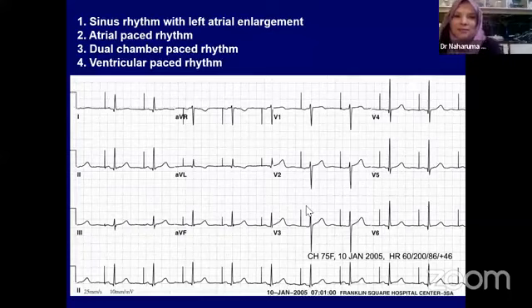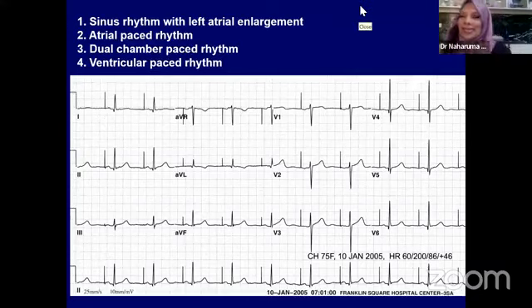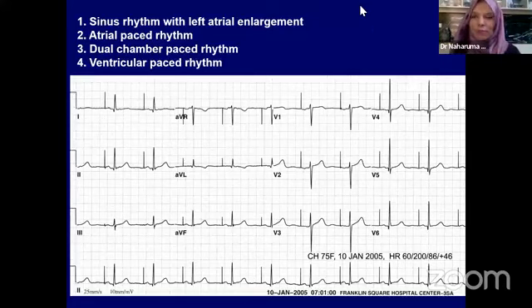Yes, sir, to correlate. And there is another question that Dr. Arif Hussain asked: how frequently should we do an ECG in ASD for arrhythmia? Sir, in ASD, every patient should have an ECG during follow-up, because as I said, hemodynamic changes occur, and the QRS changes that I have shown indicate the magnitude of the shunt.